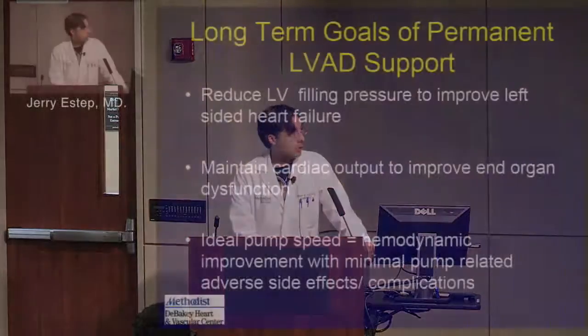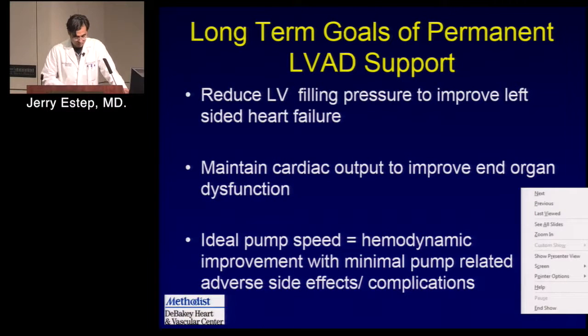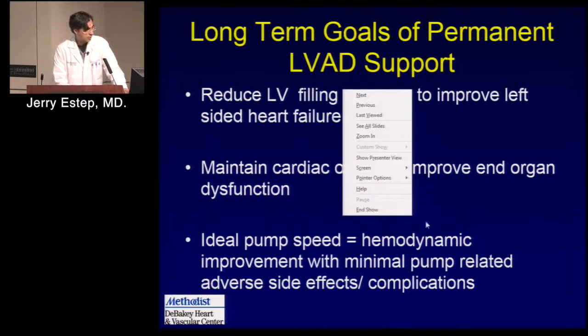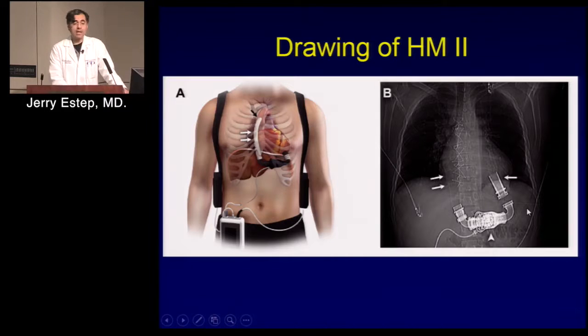So we know the purpose of an LVAD is simple. It's to minimize congestive heart failure as a syndrome. So the pump unloads the left ventricle and improves output, and thereby, for many patients, improves end organ function, but curbs heart failure. And what's unique about these continuous flow pumps is that you can set the particular speed and dial in how fast that rotor spins.